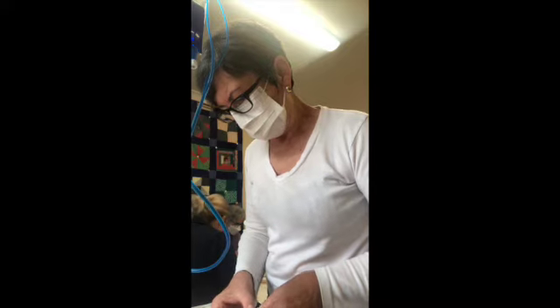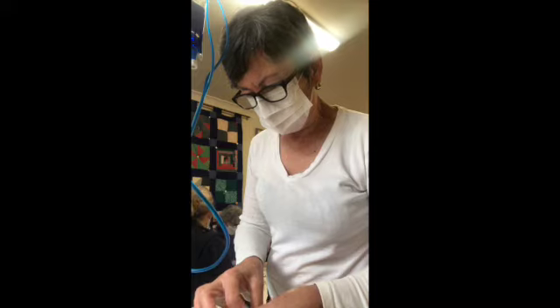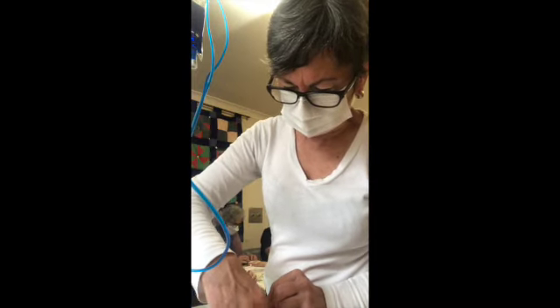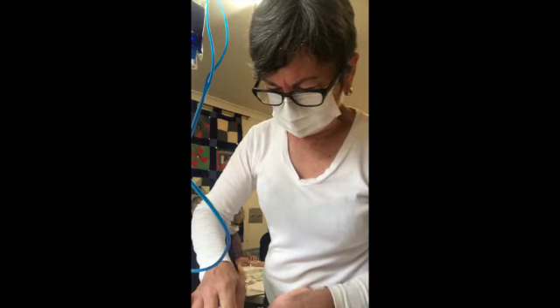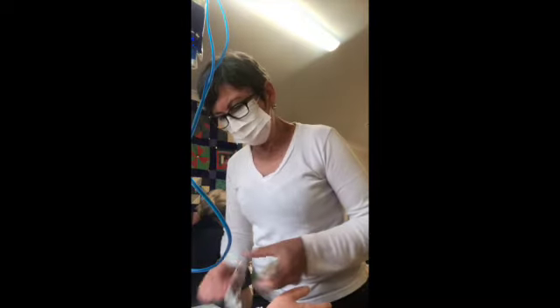I said, there's no policy for how to apply cannula dressing. Yeah. So if you pinch that with your, just the bung.